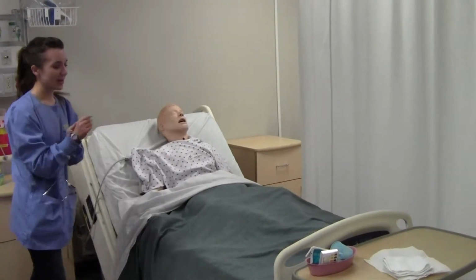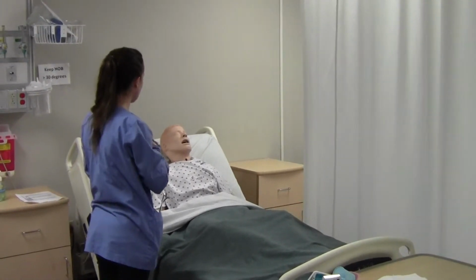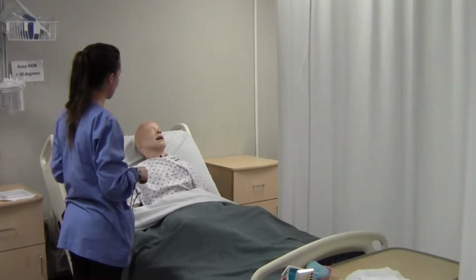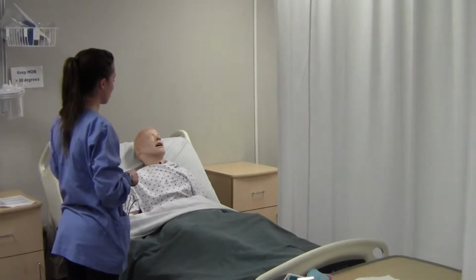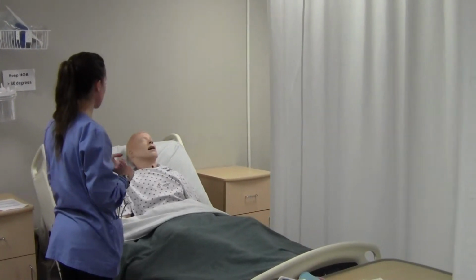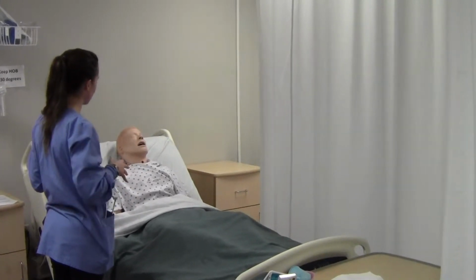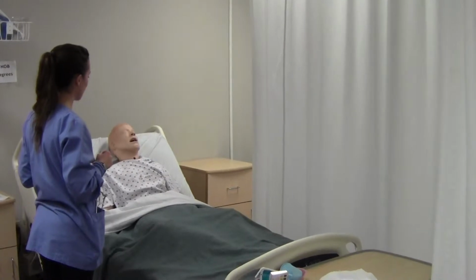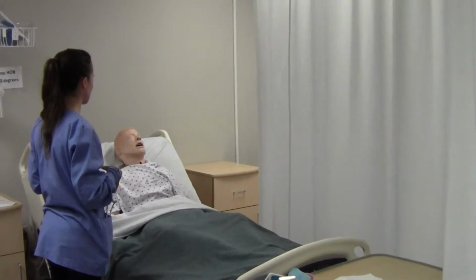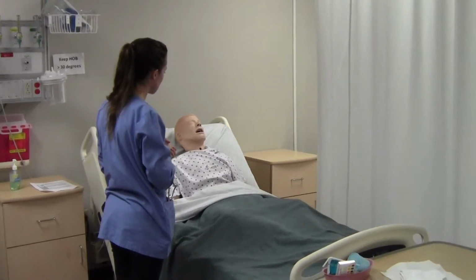Okay, excellent. Today we're going to be giving you an NG tube. An NG tube stands for a nasogastric tube. It's basically a tube that goes from your nose all the way down to your stomach, and today we're going to be suctioning out your stomach contents. That was ordered by your doctor because for the past 3 days you've been vomiting and you have a small bowel obstruction. To prepare you for any procedure, we're going to have to help that bowel obstruction. We're going to make sure that your stomach is all clear and suction free, so that's why we're putting the NG tube in to suction your stomach, and it also gives you a bit of a rest so you don't have to keep on vomiting. Before we begin though, do you still consent to this procedure?